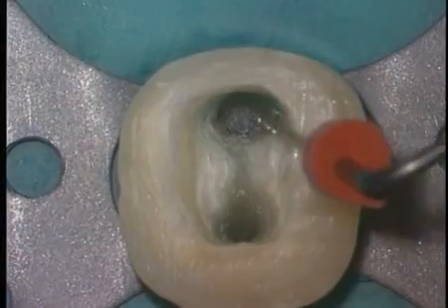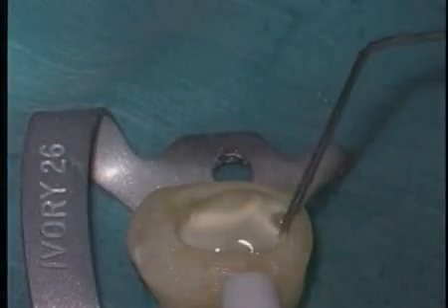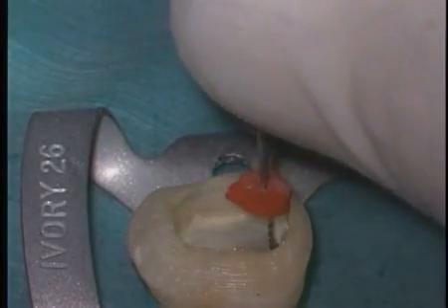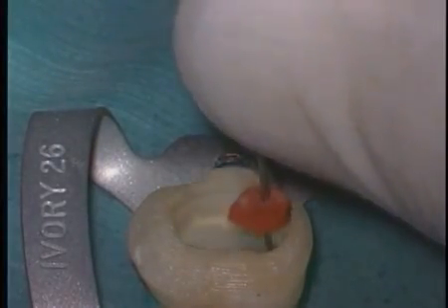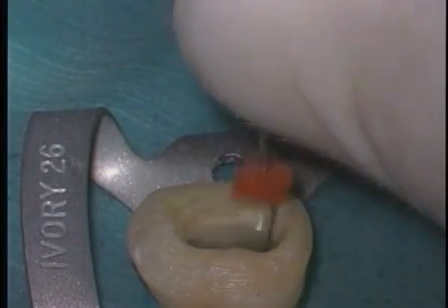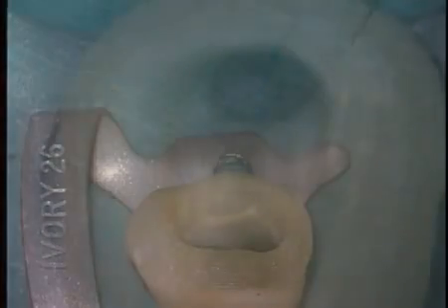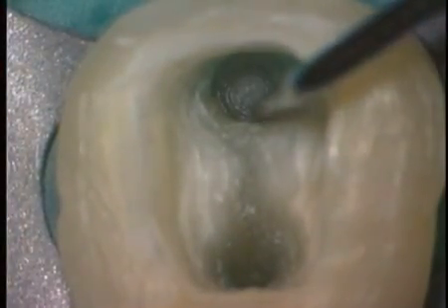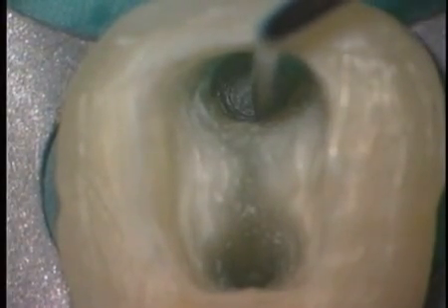The biggest challenge in treating cases where ledges are not removed is trying to have the canal smooth and flowing so that we can, in fact, fit the master cone. Oftentimes, the master cone will go down the canal, bottom out on the ledge, buckle, and not be able to be carried to length. In this occlusal view, we can see the severity of the ledge and how cone fit could be challenging.